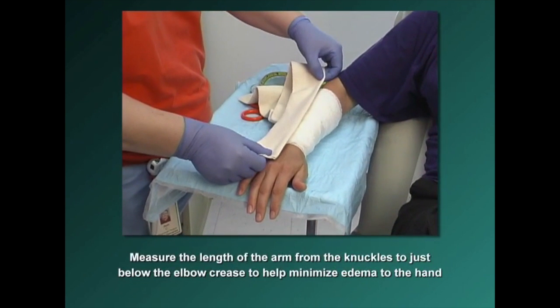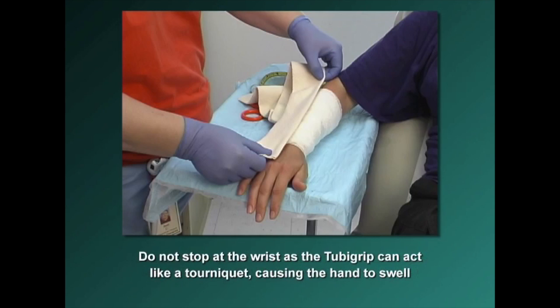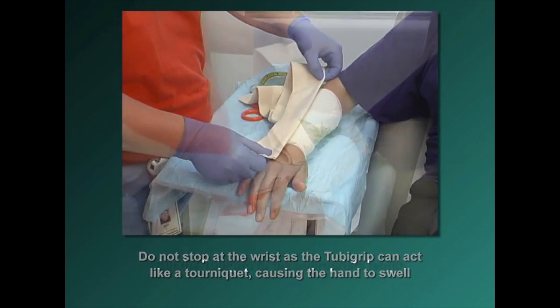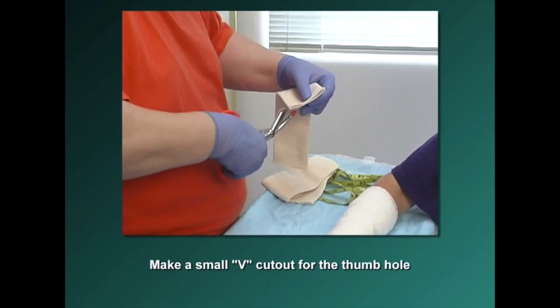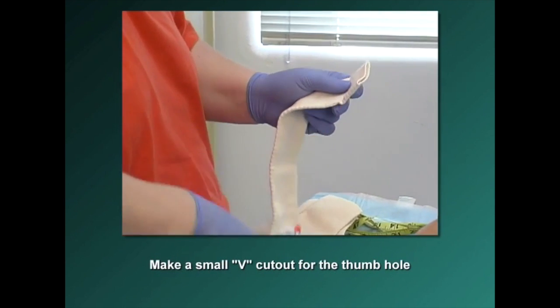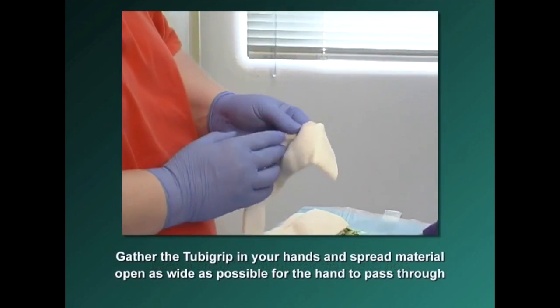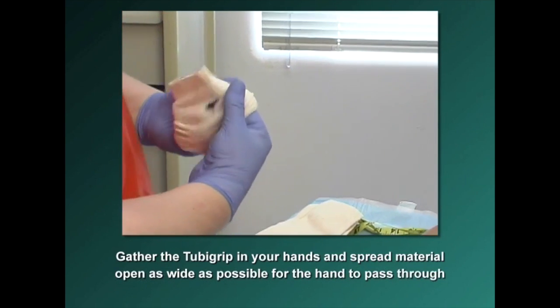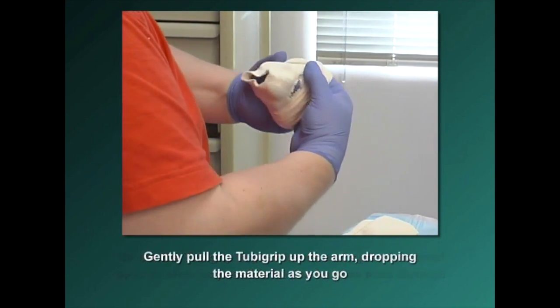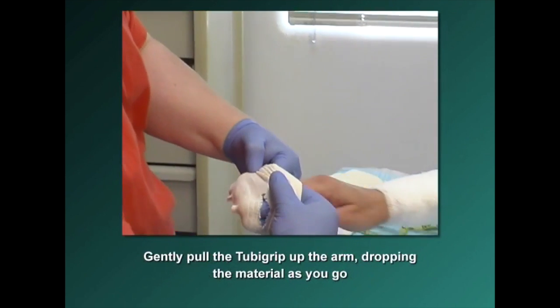Next, measure the length of the arm from the knuckles to just below the elbow crease. This will help minimize edema to the hand. Do not stop at the wrist, as Tuba Grip can act like a tourniquet, causing the hand to swell and making it difficult for the patient to stretch and perform functional tasks. Cut the Tuba Grip to the appropriate length and make a small V cutout for the thumb hole. Gather the Tuba Grip in your hands, spread the material open as wide as possible for the hand to pass through, then gently pull it up the arm, dropping the material as you go.